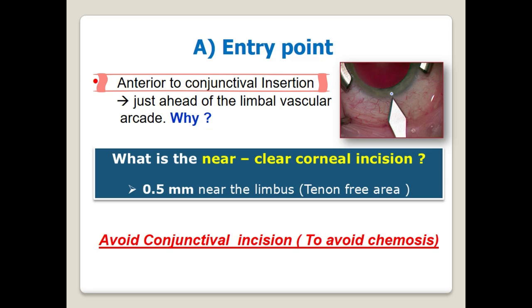Also, being away from the optical center of the cornea means the resultant surgically induced astigmatism will be minimal. However, some surgeons prefer to move 0.5 mm nearer the limbus to get better wound healing. This is called a near-clear cornea incision.